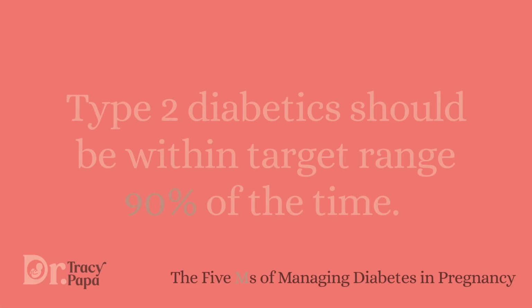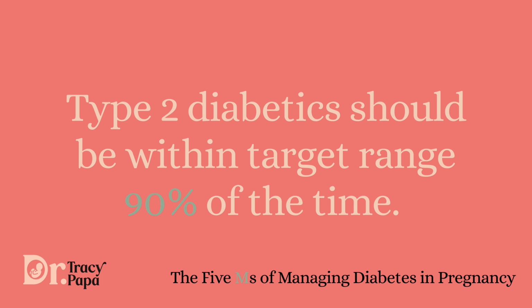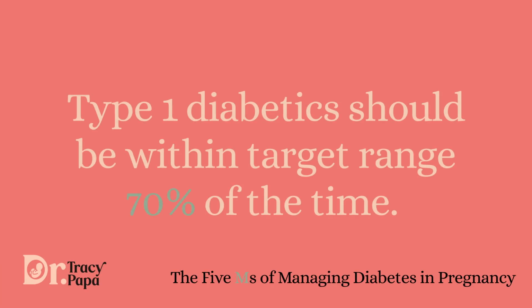Equally important for you to write them down if you're using a glucometer, or to bring your device with you whenever you go to the doctor's office so that you can sit down and we can go over these values together. The numbers that we're looking at for gestational diabetes and with type 2 diabetes is that we want your glucose values to be about 90% in range. In other words, 90% of the time we want your blood glucoses to be in that target range. And for a type 1 diabetic, those glucoses tend to be a lot more labile, so we look for an ideal of about 70% in range for those glucoses.